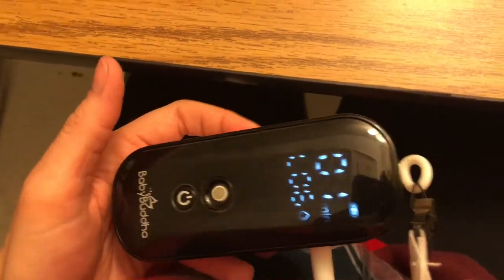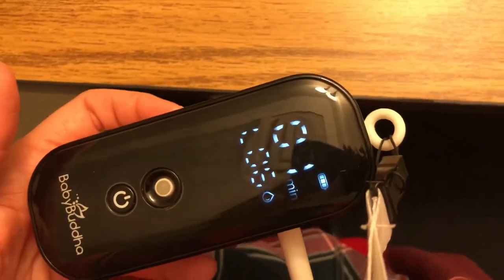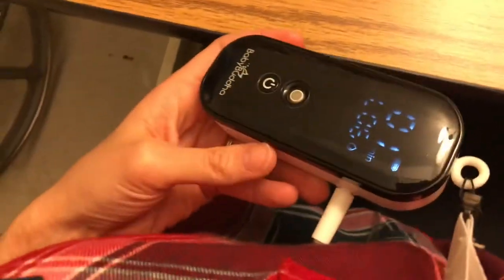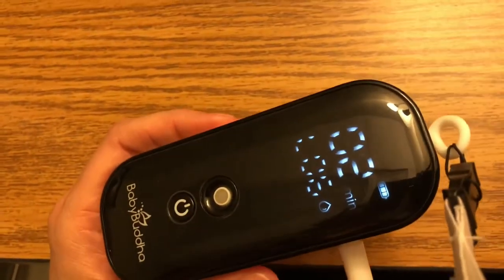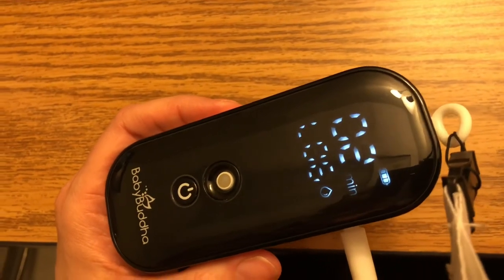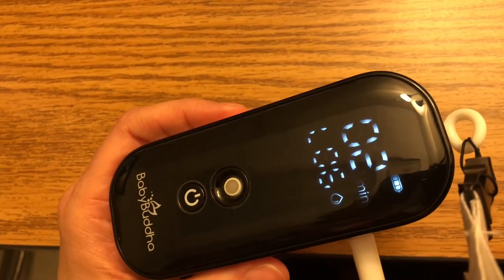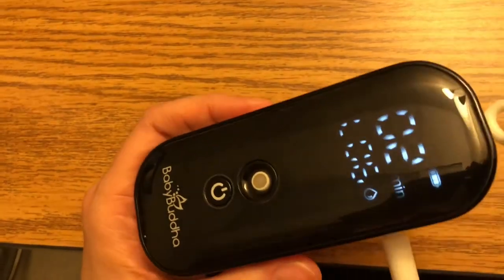I usually wait for it to get to five in the letdown mode and then switch over and do level six in the expression mode. Six is just comfortable for me. It does have a stronger suction than the Spectra S2, which is really gentle. I used the Spectra S2 during my first breastfeeding journey with my first son, and then I discovered the Baby Buddha because it's completely mobile — I'm not attached to the wall and can get up and walk around if I want to. Super convenient.